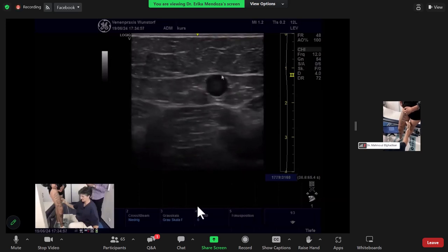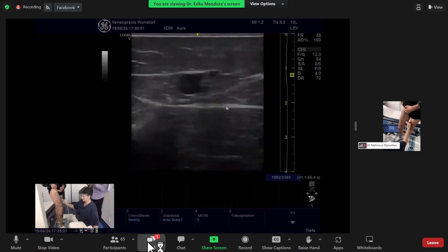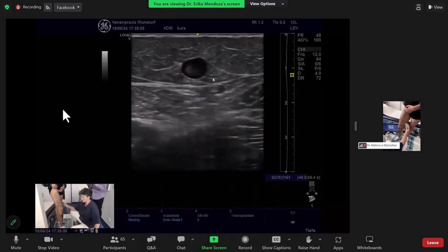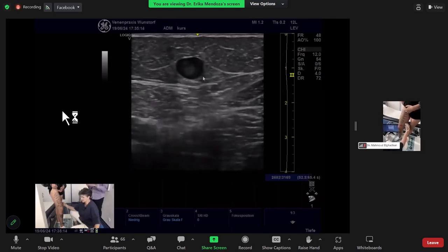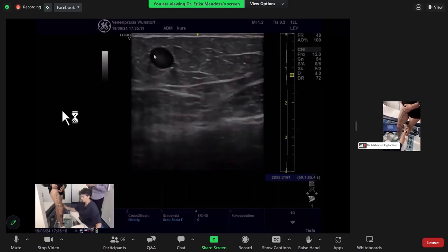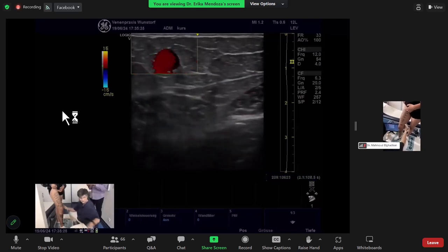This is the great saphenous vein covered by the fascia, on the muscle fascia. This is the wonderful saphenous vein. And attention, this is the large vein like Mohammed said just before. Here is the saphenous vein covered by the fascia, and here is the large tributary outside the fascia. This is a wonderful image, and we will start doing manual compression.